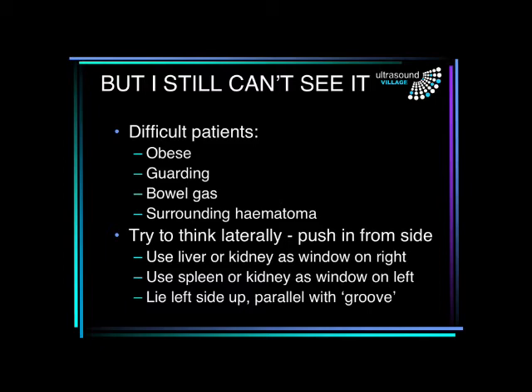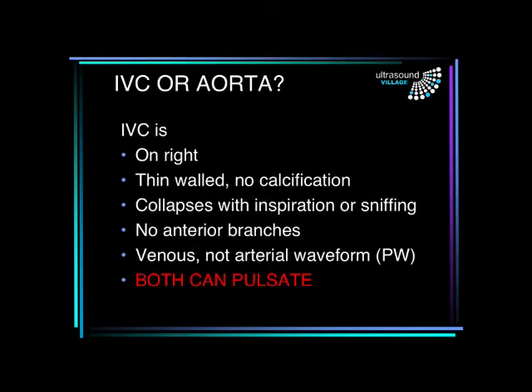Most commonly what we'll do is roll the patient on their right side — left side up. In particular for the obese patient, there's often a little groove or indentation where their large abdomen comes around to the side. Put the probe in there and press in from the side. But if you do this, you have to be very careful that what you're seeing is actually the aorta and not the IVC accidentally. This is one of the most important things: make sure that it is truly the aorta that you're seeing.